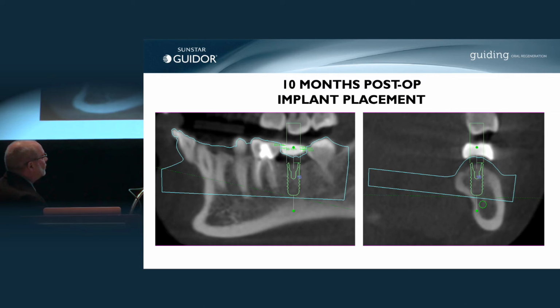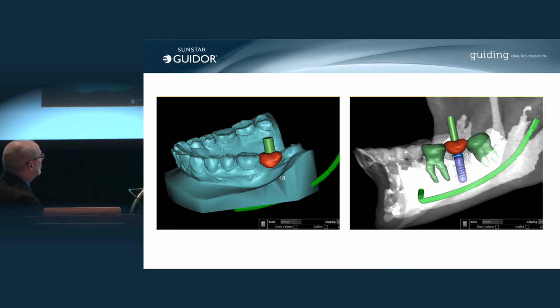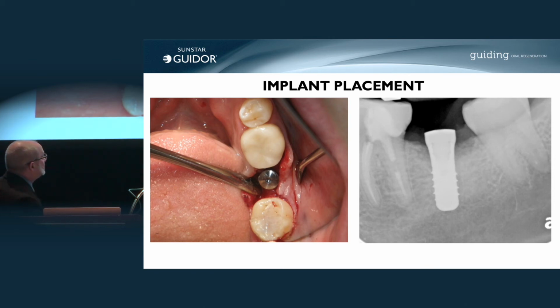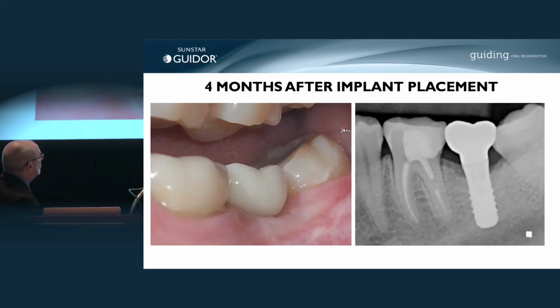So in any case, although part of this is gone just by placing the implant and doing the osteotomy, we have a very nice buccal plate that wasn't existent before, and very good height of the ridge and width. Again, you can see the merging with the scan. Here, I have to lay a little flap so I can get my core out of it. The implant is placed. 4 months after, the implant was restored. Again, the bone is going to end up right at the area where the polish color starts.